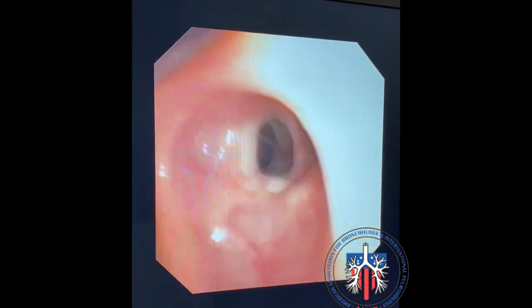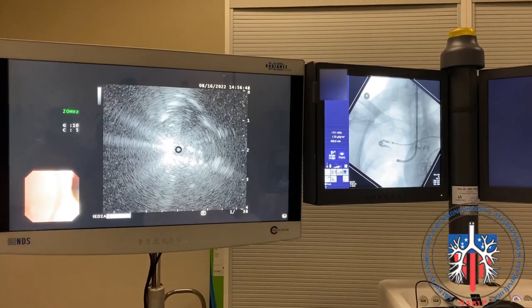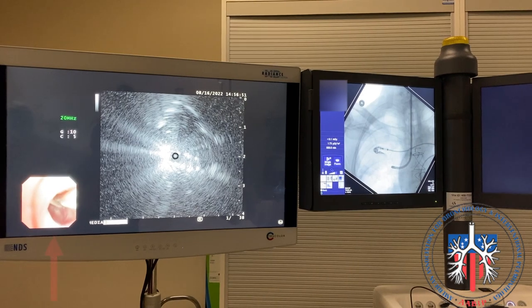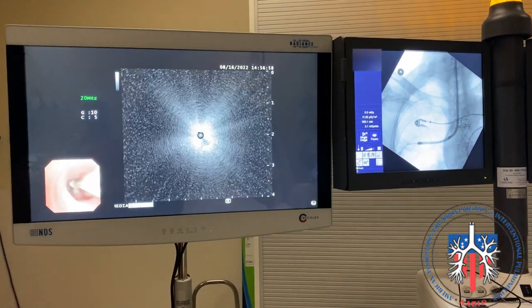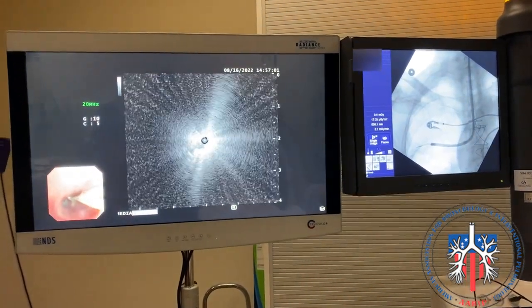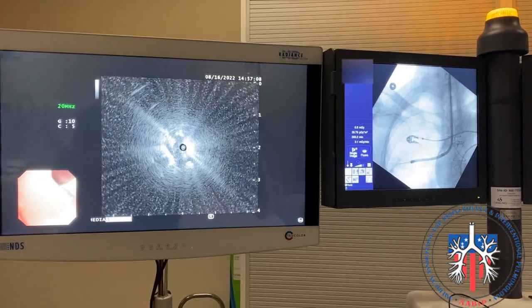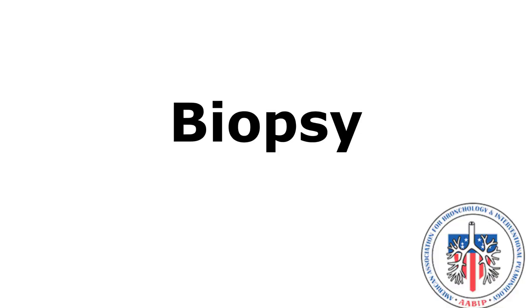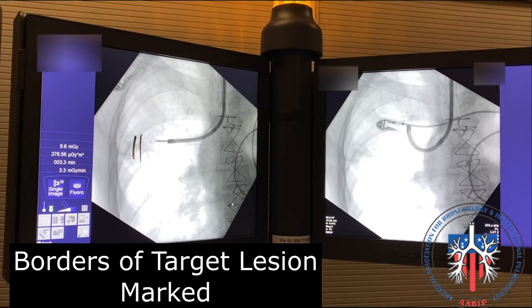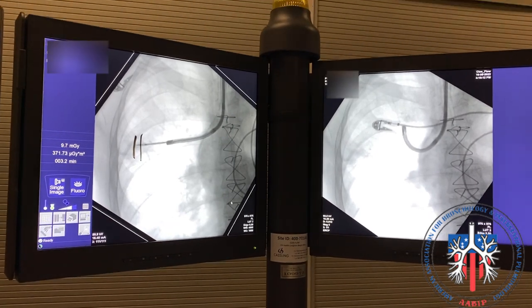The nodule is located in the posterior segment of the right upper lobe. Mucus is visible in the airway. This shows the white light view, ultrasound view, and fluoroscopy view. The radial probe is advanced into the lung parenchyma. Fluoroscopy is turned on and the radial probe is used to identify the nodule. The nodule is identified and the fluoro image is saved. The target for biopsy is marked with a pen based upon the radial image acquisition. In this example, biopsy forceps are being used.